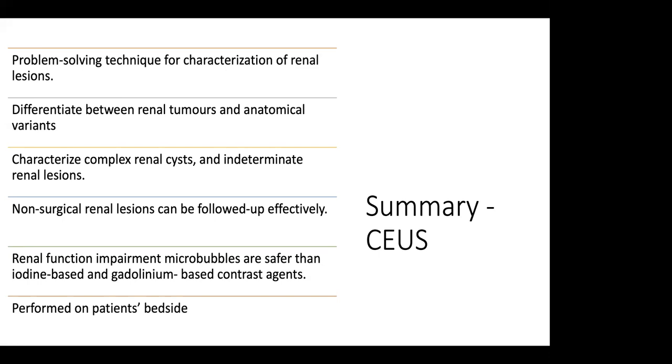Second, a lot of contrast-enhanced ultrasound is based on studying vascularity and then interpretation in context of other imaging. So my thoughts are that it will be very difficult for a surgeon to carry out contrast-enhanced ultrasound in an office situation by himself, because that requires multiple heads.